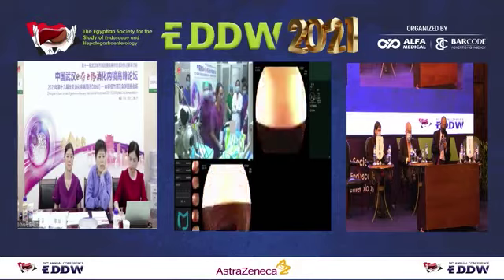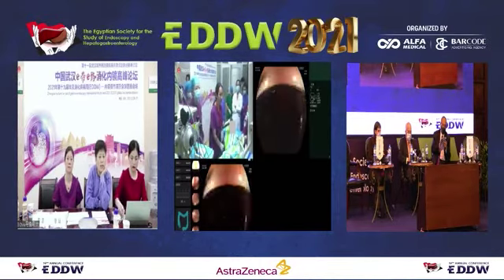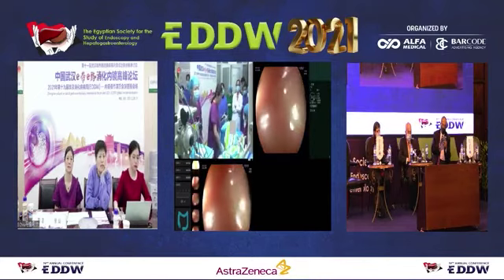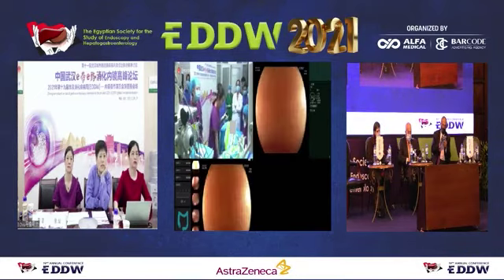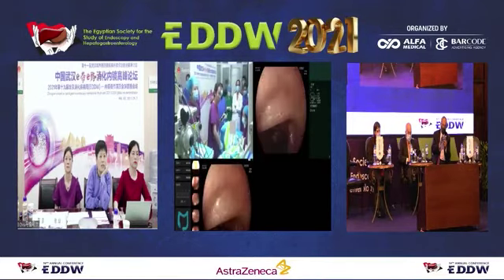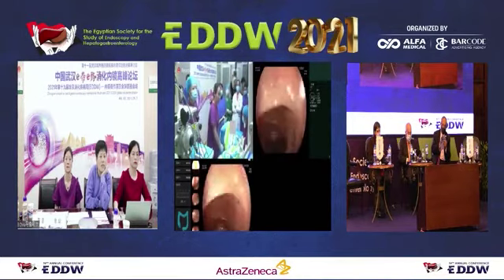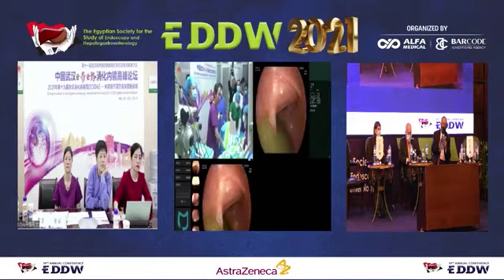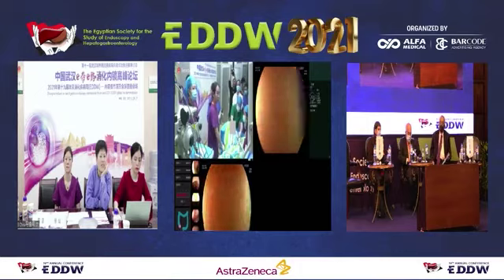Some people think NBI and BLI make it easier to find polyps, but in my opinion, the most important part is the white light.